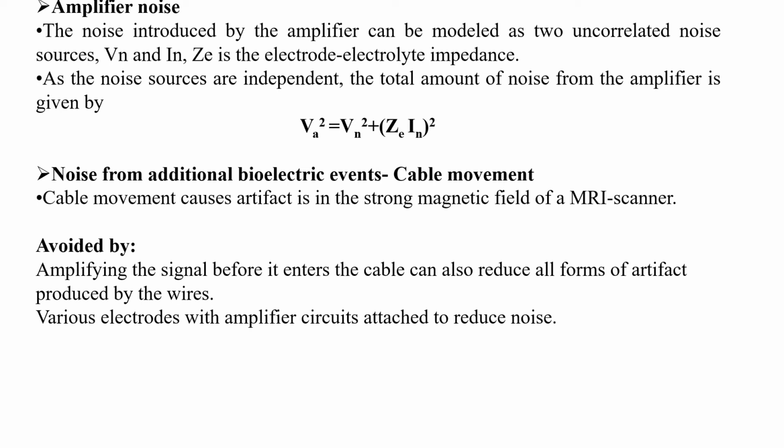They have given two ways to avoid this. It can be avoided by amplifying the signal before it enters the cable, which will reduce the artifact. Then, using various electrodes with amplifier circuits attached will reduce the noise.